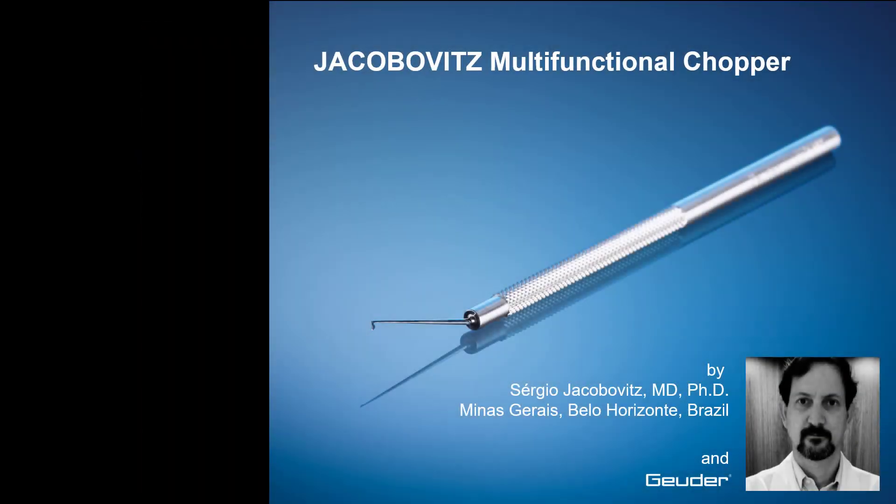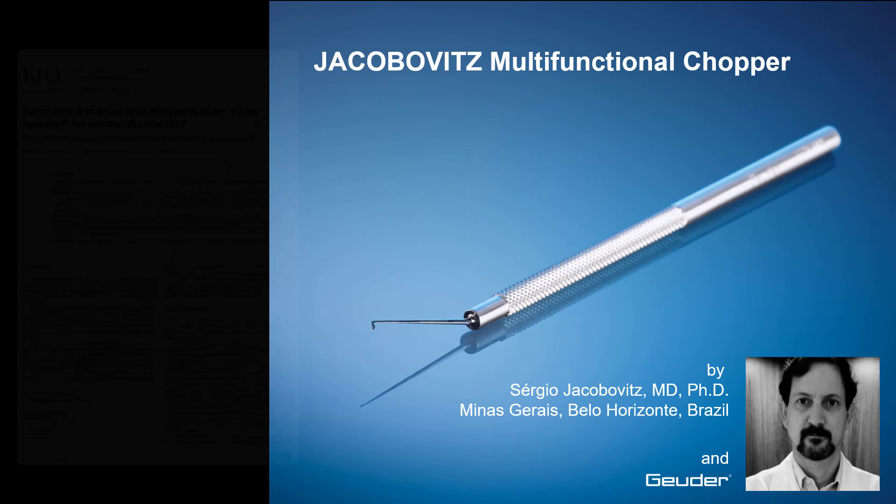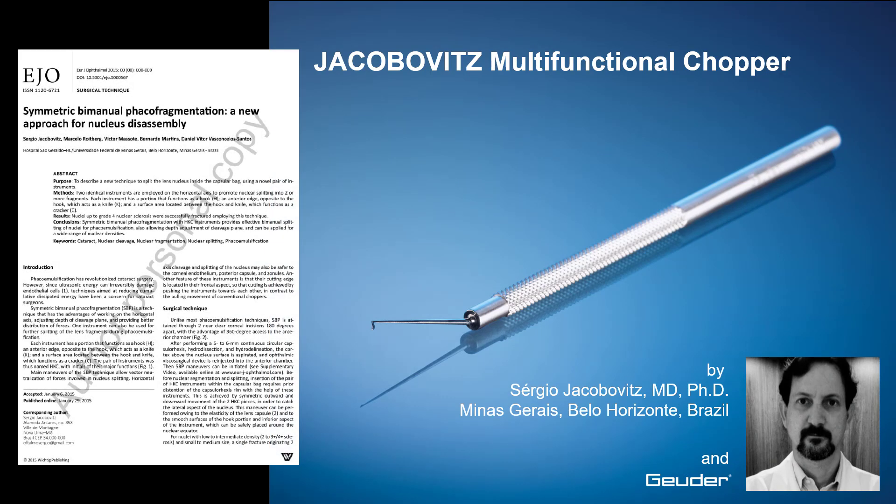The Jacobovitz multifunctional chopper is versatile and capable of reducing the number of instruments, movements and ultrasound energy during phaco procedures. More than 1,500 surgeries were performed without complications. Symmetric bimanual phacofragmentation, published in the European Journal of Ophthalmology.